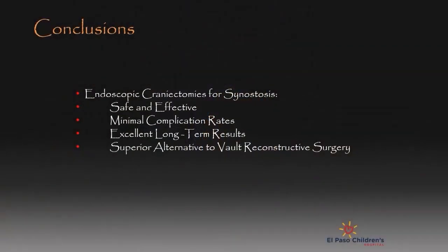Thus, in summary, we believe that endoscopic craniectomy for the treatment of craniosynostosis is a safe and effective way. It is associated with minimal complication rates, and when the patients are followed for many, many years, the results are excellent. We believe that it is a superior alternative to calvarial vault reconstructive surgery and should be part of a full informed consent given to all prospective parents.